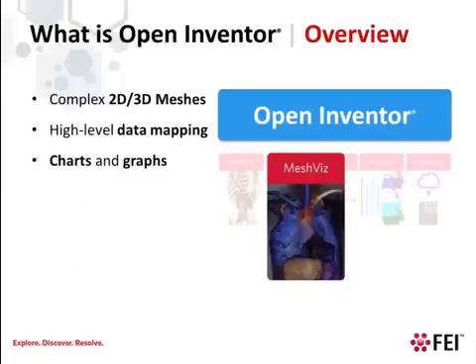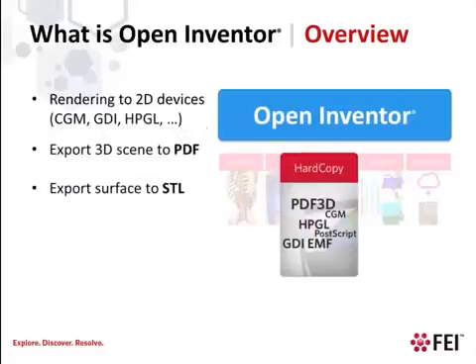The MeshViz extension adds support for managing and visualizing surface and volume mesh data. This is valuable, for example, in finite element analysis or computational fluid dynamics. It also brings an extensive collection of charting objects.